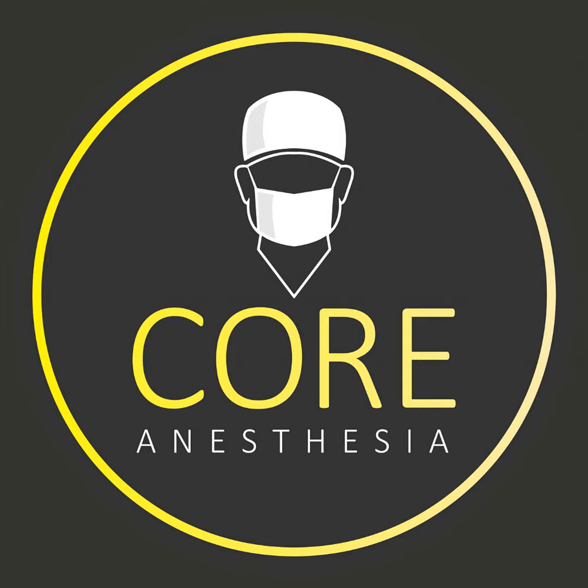And so let's just talk here now really about the waveform. So I encourage you, if you have time, to look at a waveform while we're talking about this, it'll make a lot more sense. Really, with all these waveforms that we go through, if you are able to look at a picture, just Google a picture of the waveform, it'll make a lot more sense as we walk through it. So with capnography, there's 4 phases, phase 1 through 4. We start with phase 1.